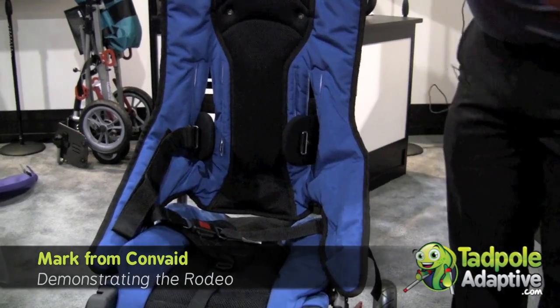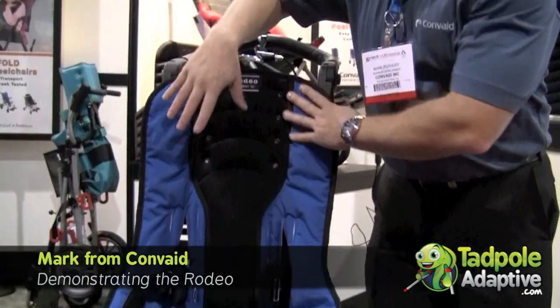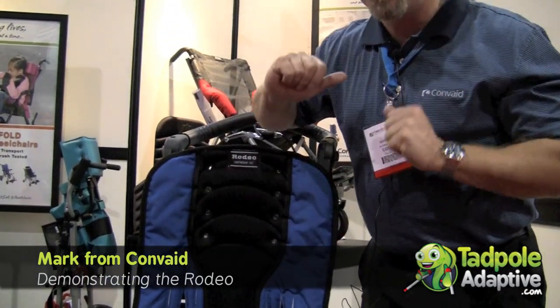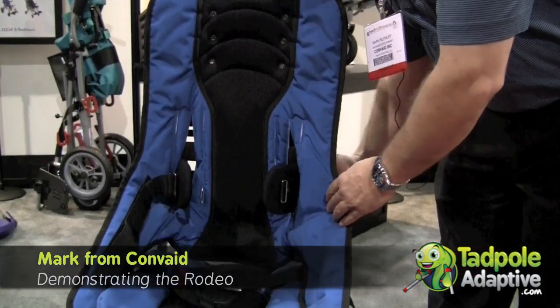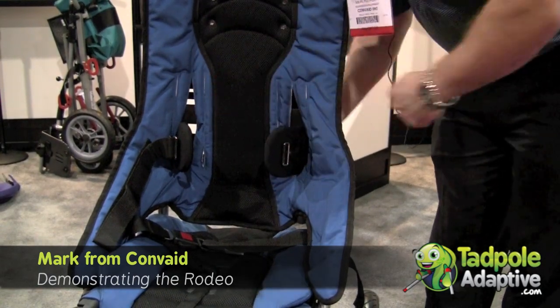The Rodeo offers comprehensive positioning. Though I'm not showing it today, you can get it with an extended headrest, a headrest extension, an oxy headrest, or padded head wings. You can also get it with firm laterals, which I'm showing here — they are swing-away laterals and very adjustable. I can move them up and down, east and west.